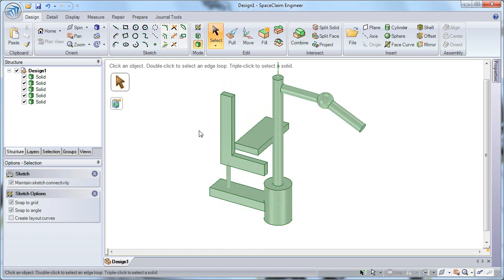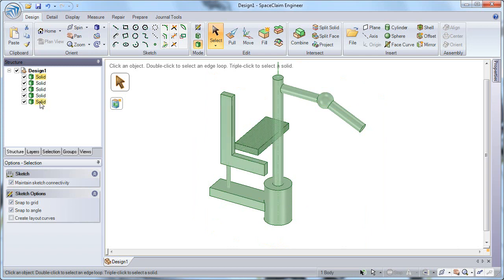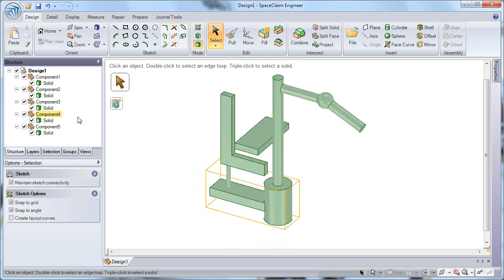So let's look at our structure tree again. We can see that we have our table, our arm, our chair, our base, and our tower, all as individually defined solids. And we can also take those and create components from them by selecting all 5 of the solids, holding down the right mouse button, and choosing Move Each to New Component. And now we have a new component representing each of those solids in our structure tree.